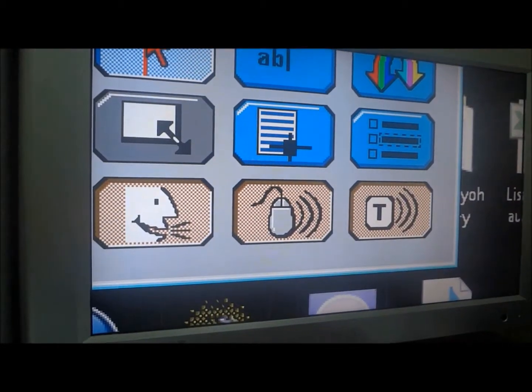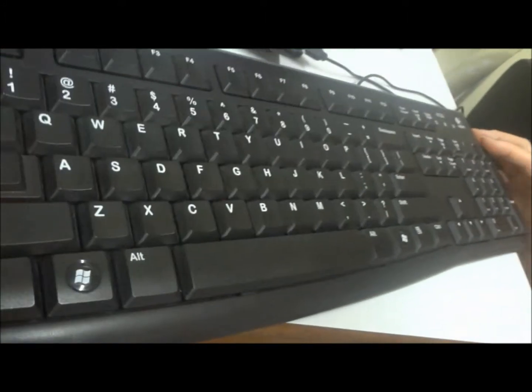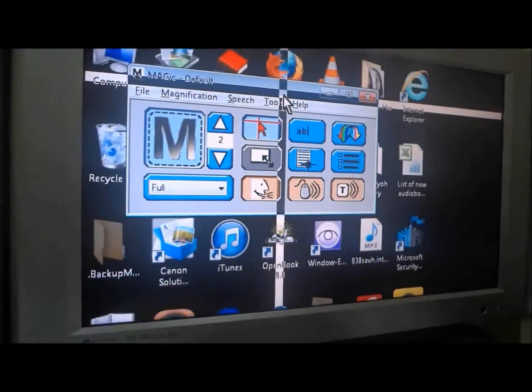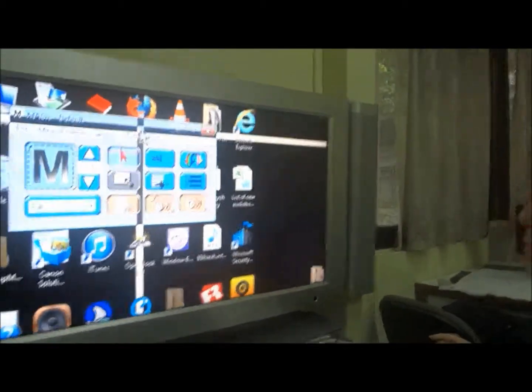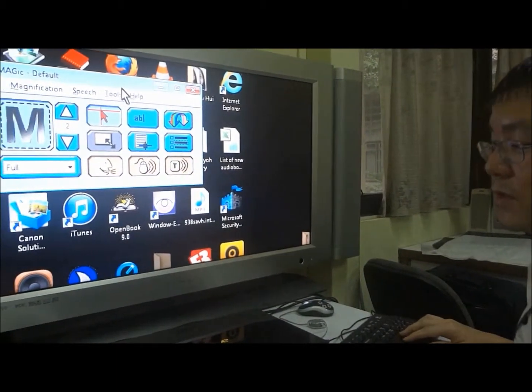Okay, back to the keyboard. This will reduce magnification. So caps lock plus the minus key on what we call the number pad. So back to the screen. 4x, 3x, 2x, 1.9x, 1.8x. And you hear the voice announcing the magnification level. So 1.92x.